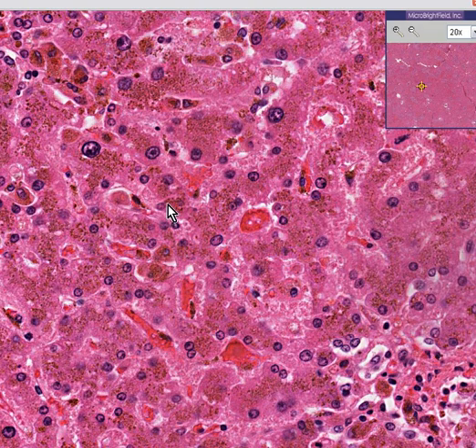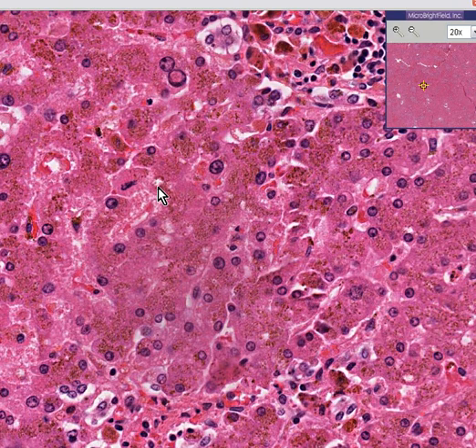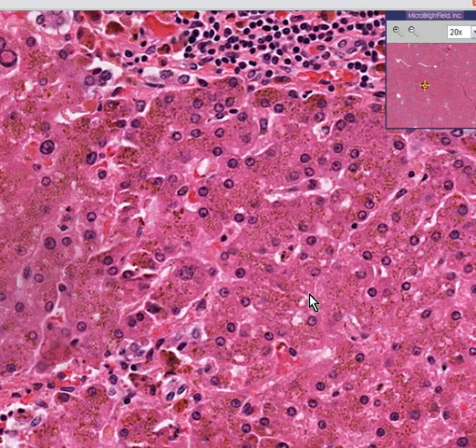Hemochromatosis versus hemosiderosis. In hemosiderosis, you see an increase in iron in the liver, but not particularly in the hepatocytes themselves, predominantly in these Kupffer cells or macrophages or reticuloendothelial cells. That's one definition. Another definition is that in hemosiderosis, there's usually no functional liver disease. There's usually no cirrhosis. There's usually no significant impairment of liver function. In hemochromatosis, the end stage is usually cirrhosis, and there is usually profound liver dysfunction. So that is the difference between the two.